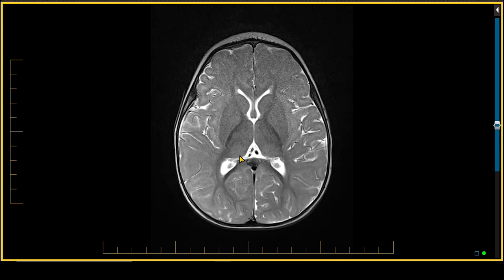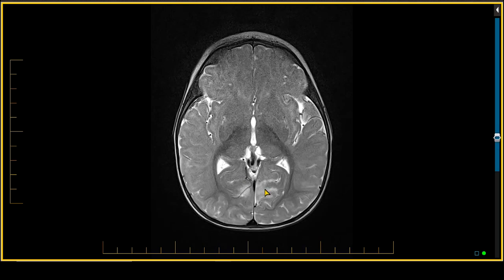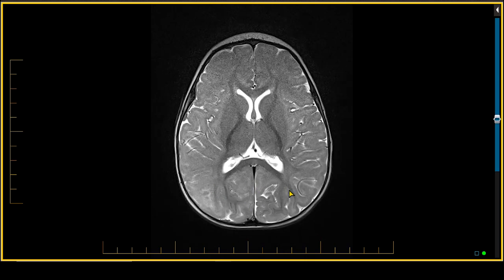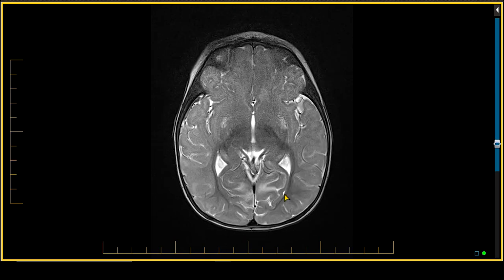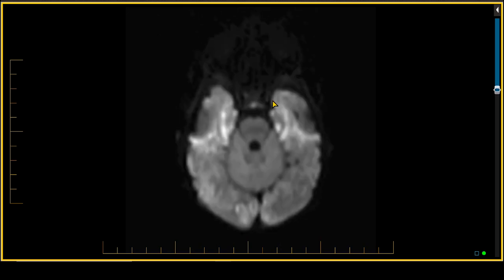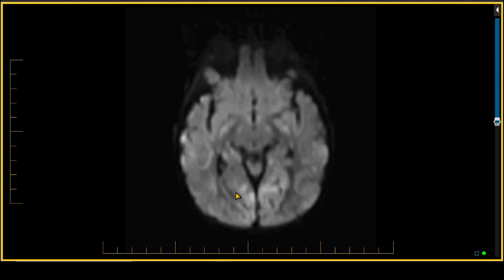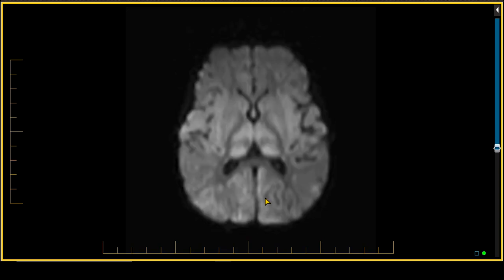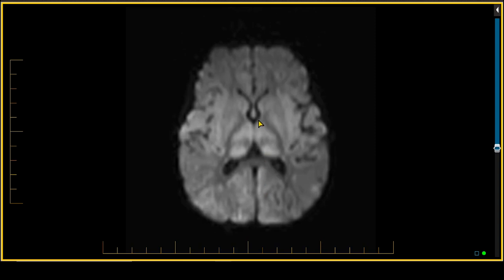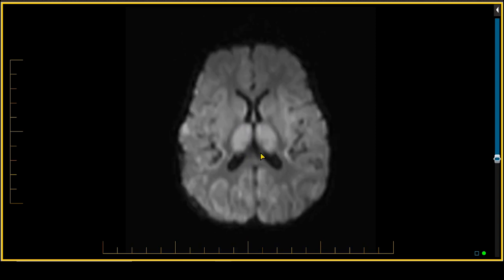Once again, we can see, as in the previous case, high signal intensity on T2-weighted scanning, which is extending into the occipital region and parietal region bilaterally and fairly symmetrically. The diffusion-weighted scan is even more striking, showing cortical high signal intensity in the medial aspect of the occipital lobes as well as extending to the temporal lobes. You also see bright signal intensity bilaterally in the thalami.